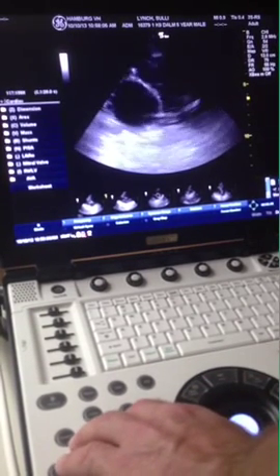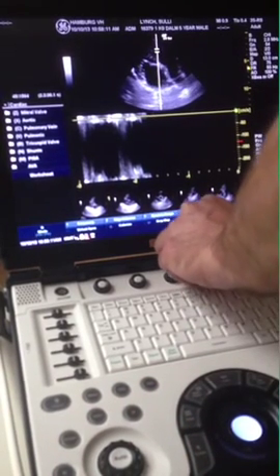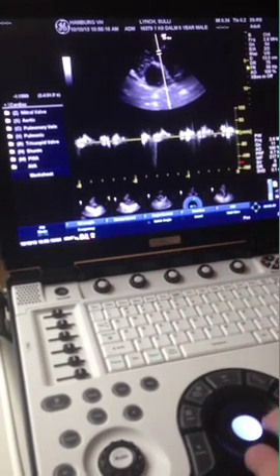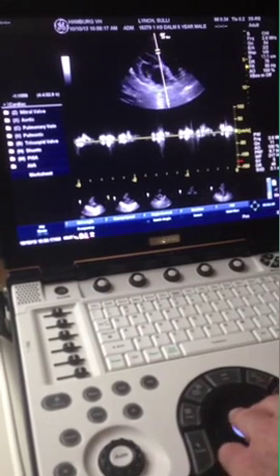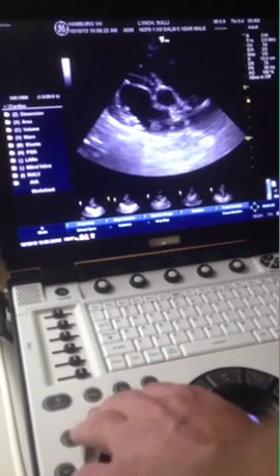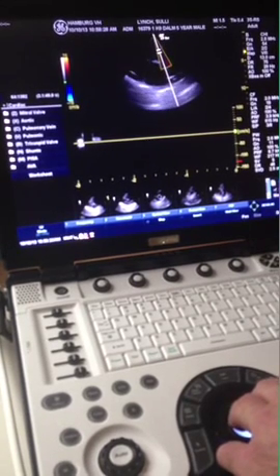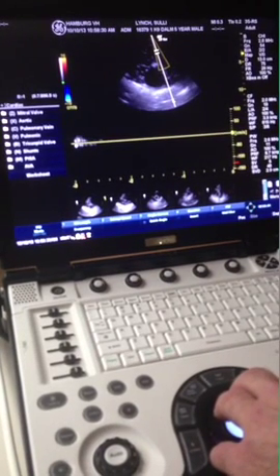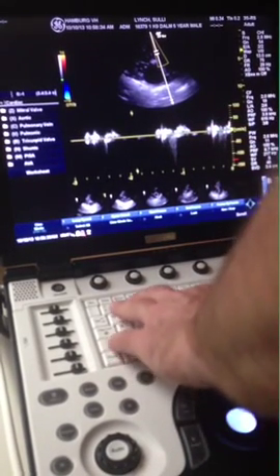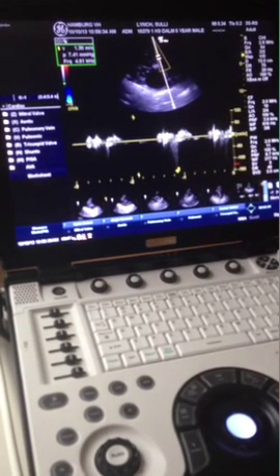From here I can get my Doppler as well. I'll lower my baseline. This dog has a little bit of tricuspid insufficiency. I'll use color first to identify the regurgitant jet, but I'm still going to use spectral Doppler on top of it. I get a little tricuspid insufficiency here — I'll mark the tricuspid valve and measure out the insufficiency velocity, then save that.